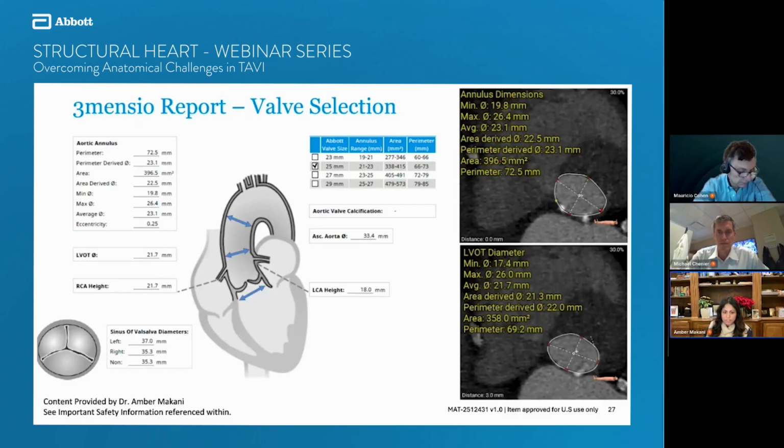But in patients who are older, or who can tolerate a little bit of PVL because there's no other option for them, certainly TAVR is not unreasonable. But I do think having a conversation with the patient about expectations is important, because what I find is if you don't set that groundwork, patients are frequently surprised when they see paravalvular leak being read on their echocardiograms later.